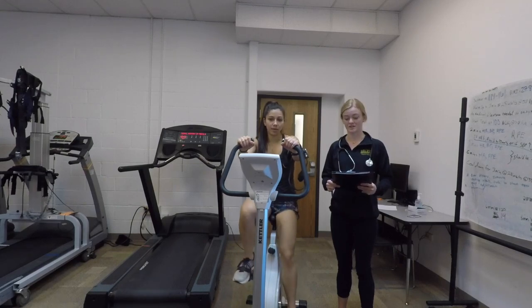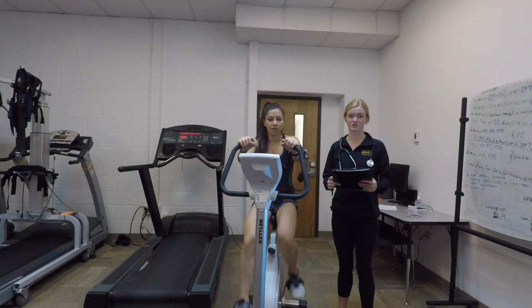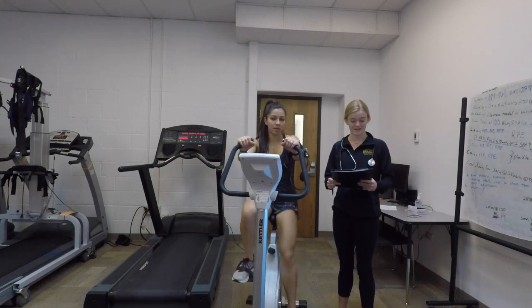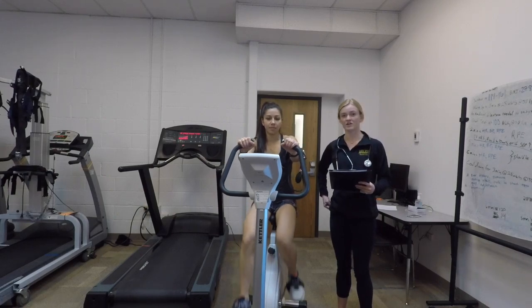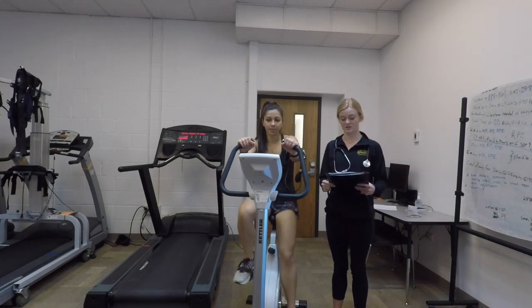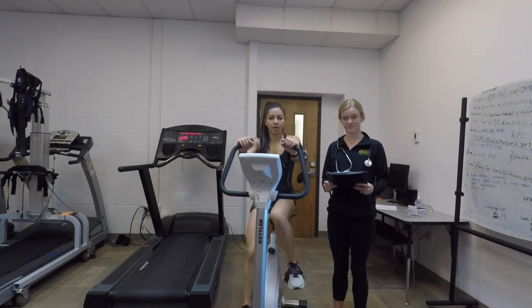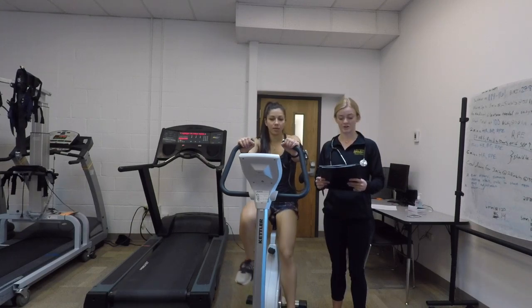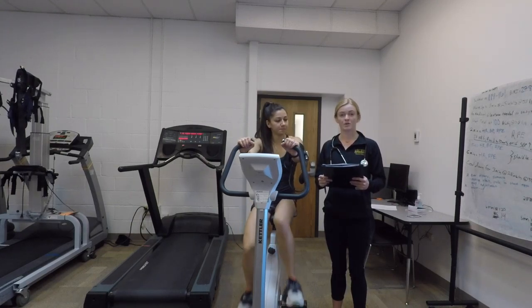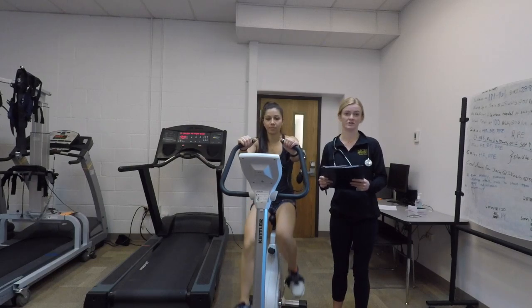Her heart rate was at 64 beats per minute and her blood pressure was 102/68. The bike seat was set at proper height at the level of her greater trochanter, allowing for about 25 degrees of knee flexion. She has been warming up for about 2 to 3 minutes now at 25 watts and at about 50 revolutions per minute, which is standard for a cycle test. I will now take her heart rate and blood pressure to make sure we have a normal response to this increase in activity.